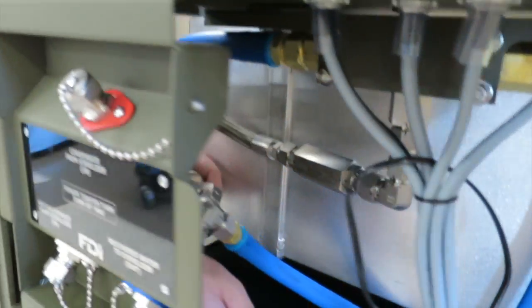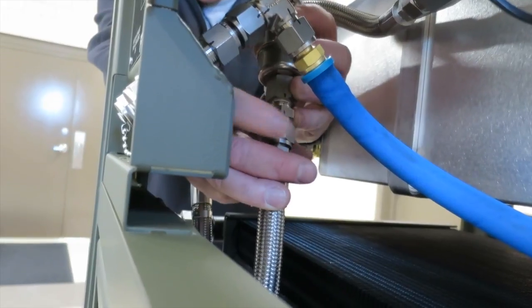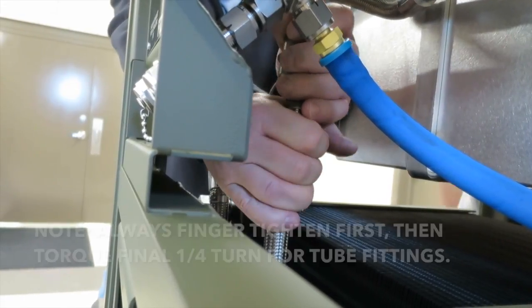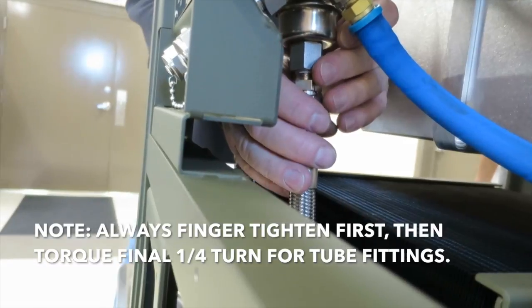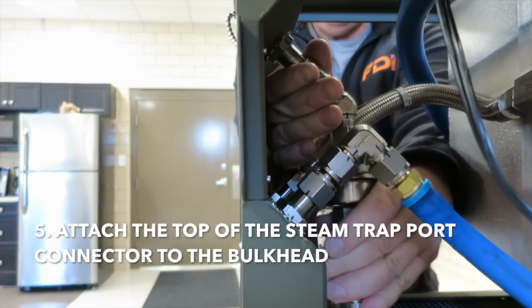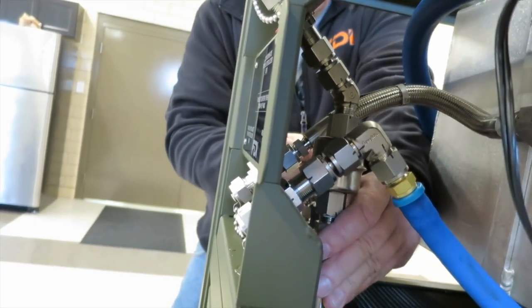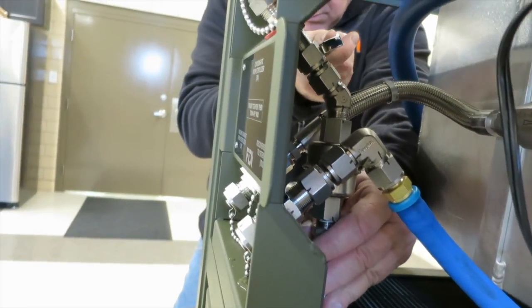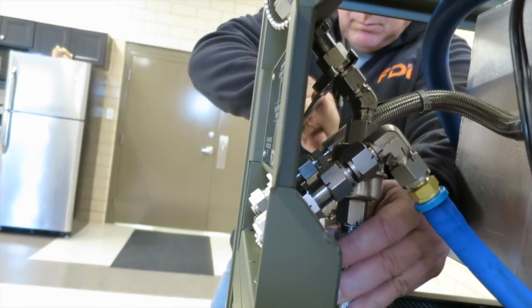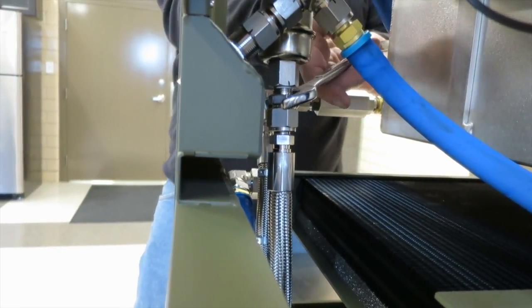Alright, now he is going to attach the bottom fitting to the hose. Again, we're going to use 13/16 to counter torque and 7/8 to tighten. So he's going to go finger tight first. It also might help to go ahead and attach the top to the fitting just to stabilize it as you're doing all the tightening. So you can get everything finger tight first and then go back and do the final quarter turns on everything. So you do the final tighten on the bottom.